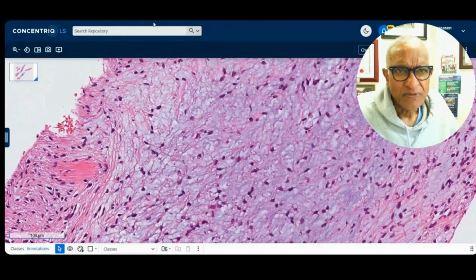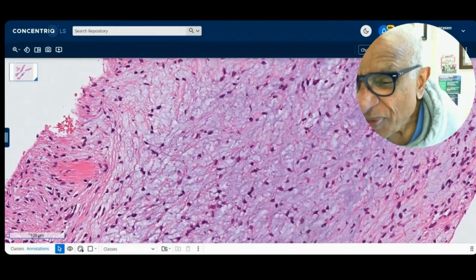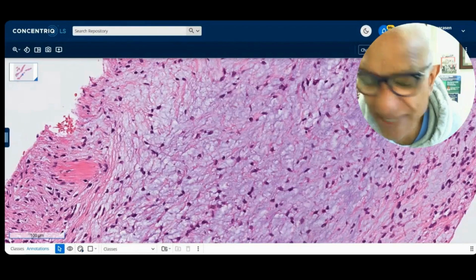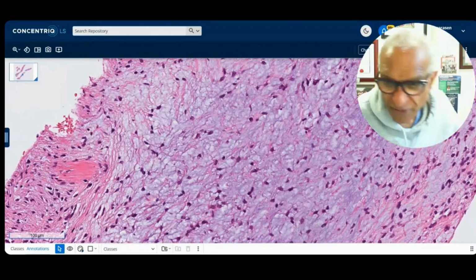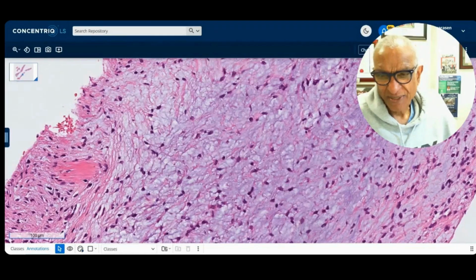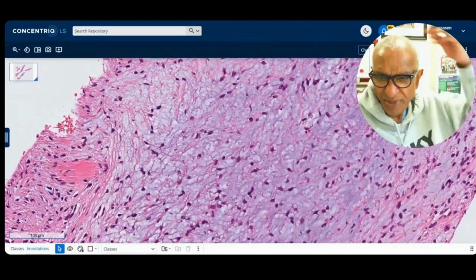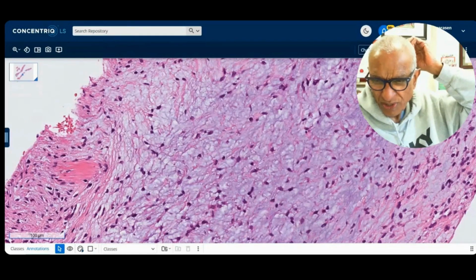Let's see how everybody is doing. How's everybody doing? Vaguely herringbone, Andy. Sorry, where's the site? Yan. Site is right shoulder, 57 female. Myxoid background, Omar. Correct. And I did not want to say that, Omar, because I wanted you to pick that up. Vaguely herringbone, neural. All right.